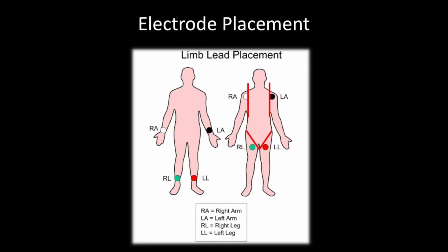Do not move them on the inside of the chest, outside of the armpit. So your armpit is one line, right here, right? If you draw a straight line, shoulder is okay, here is not okay. Keep them on the arm, as close to the chest as you can, off that red line. The same is true for the lower ones. There's your inguinal hernia right here, not hernia, why do I always say hernia? Ligament, god damn it. So, ligament right here, right? Off this, yes, okay, up here, not okay.